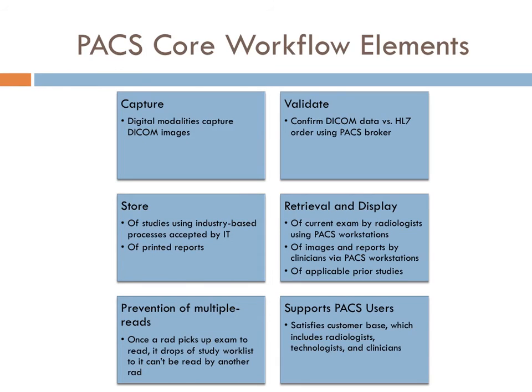There are some core workflow elements that occur on PACS. The first is capturing DICOM studies. So the digital modalities capture the actual DICOM images. This includes all types of modalities from CT, MRI, PET, general radiology to all types of the modalities. So then it actually validates and confirms the DICOM data versus the HL7 order using the PACS broker.